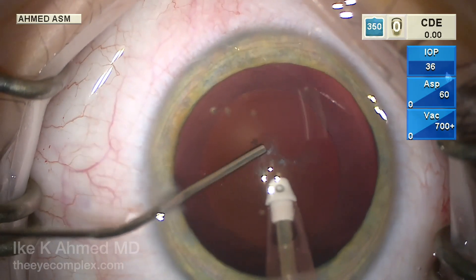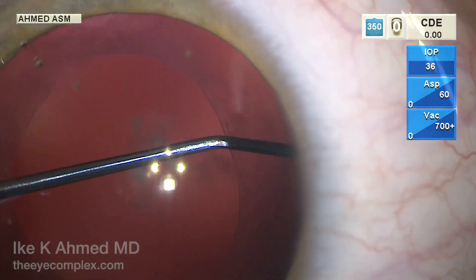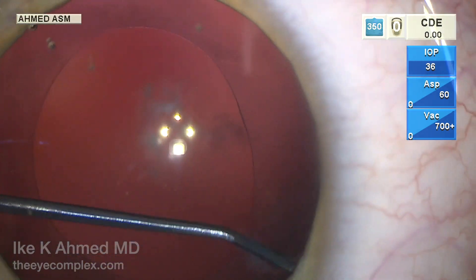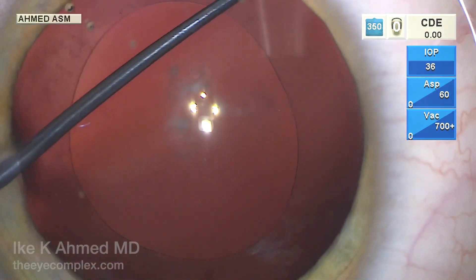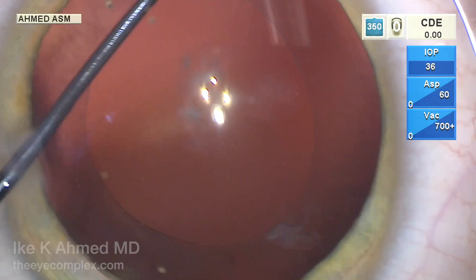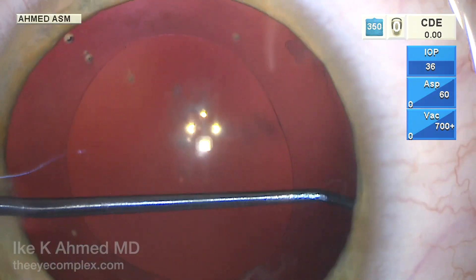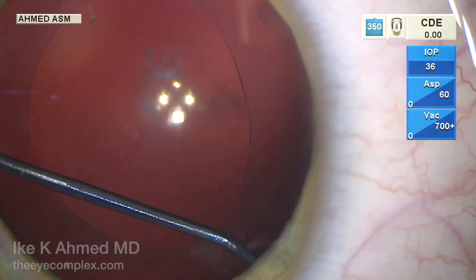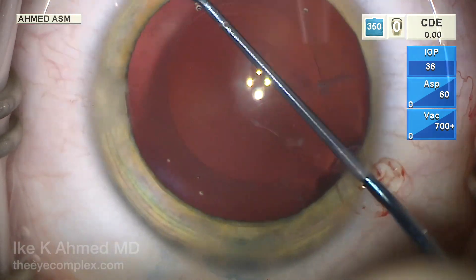We can't really peel off that lens opacity, but I am now going to use a Singer sweeper. This is a very useful approach to remove those anterior lens epithelial cells under the anterior capsule and in the equatorial region. This will help reduce post-operative lens epithelial cell proliferation and metaplasia, which can be a problem in these young eyes over time with exuberant fibrosis causing capsule contraction and opacification.